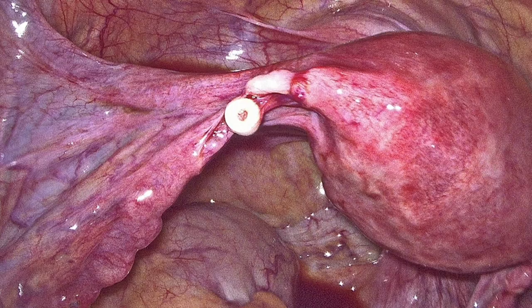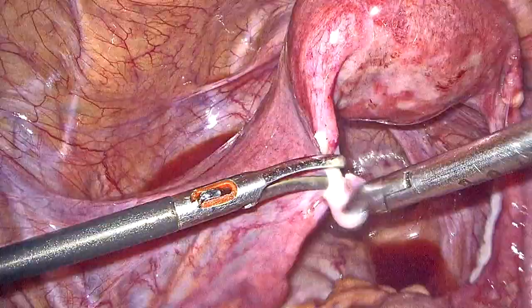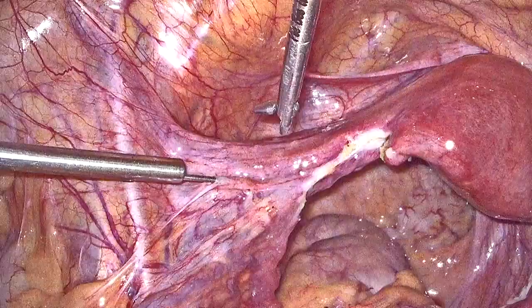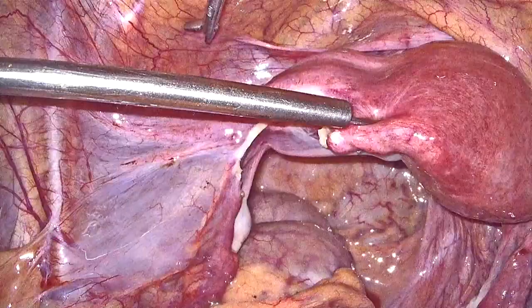In this video we will be describing the procedure of tubal re-canalization by the laparoscopic method. In order to perform tubal re-canalization it is extremely important to understand the anatomy of the fallopian tube and to realize how the tubes were ligated in the first place. In this case the tubal ligation was performed laparoscopically, but the problem was it was done too far medially.